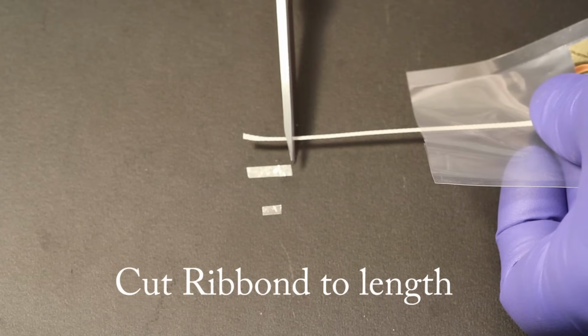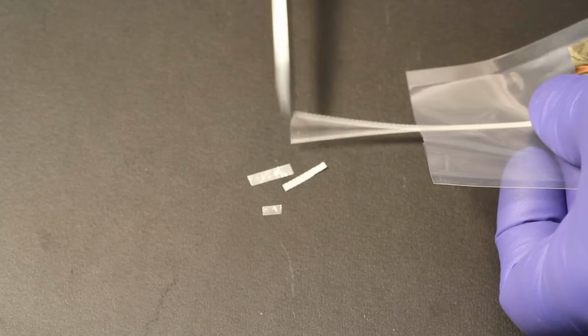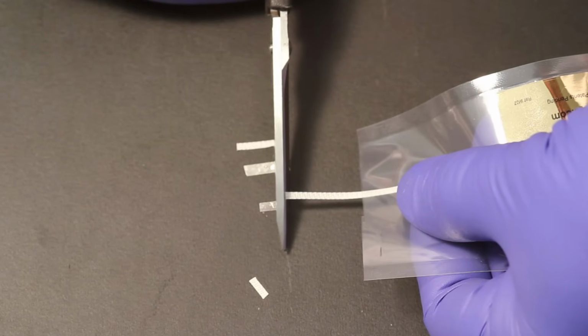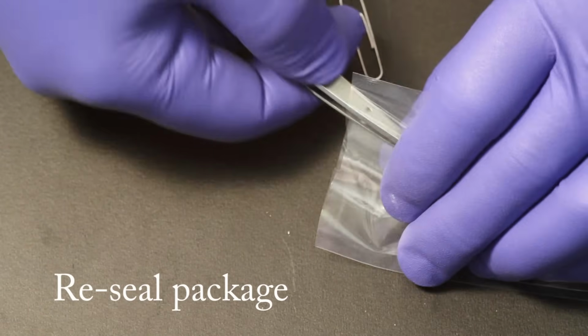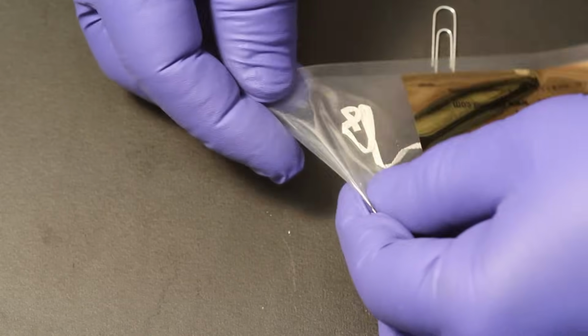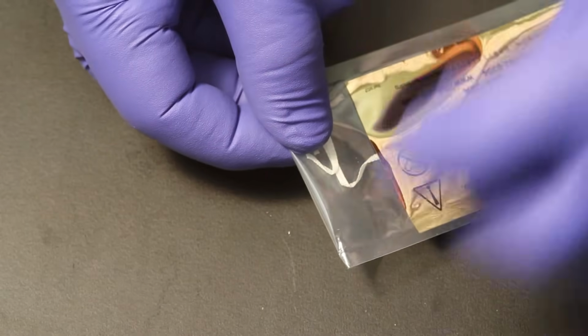Ribbon is made from the same ultra-high molecular weight polyethylene fibers used to make bulletproof vests, and normal scissors will not cut it cleanly. Reseal the ribbon by folding over the end of the packaging and securing it with the paperclip. This will help maintain ribbon's indefinite shelf life.